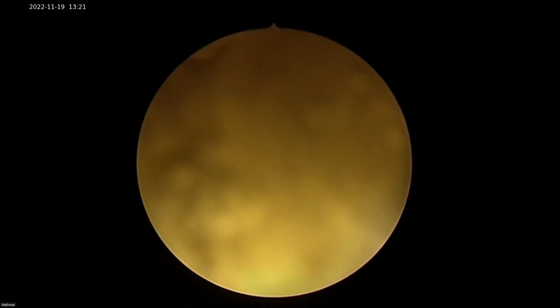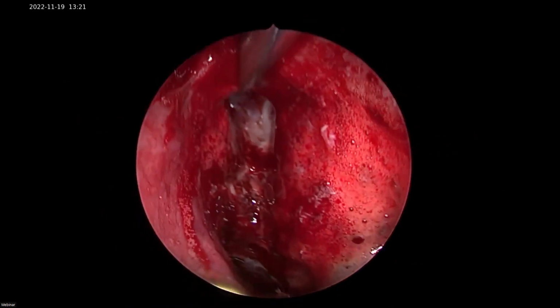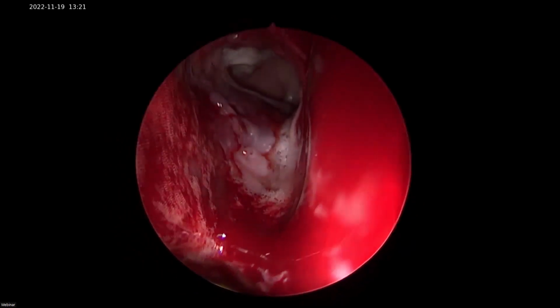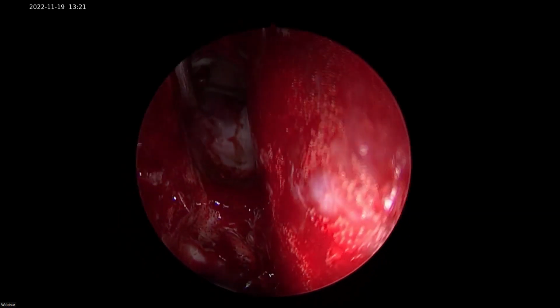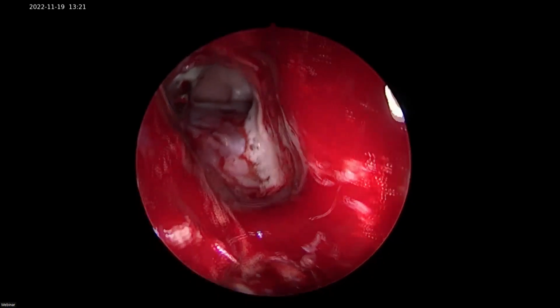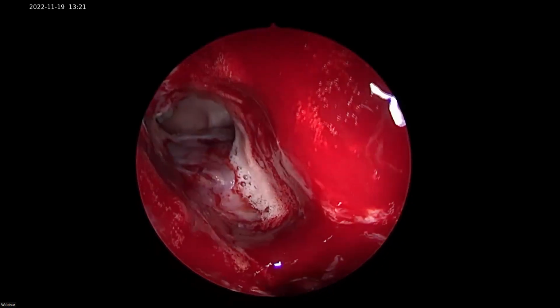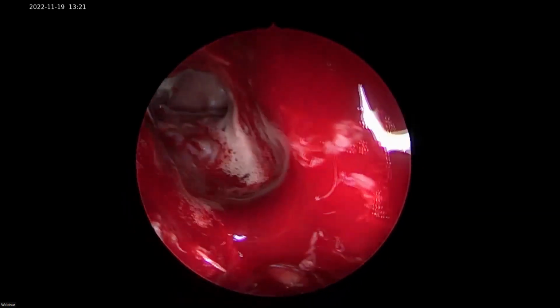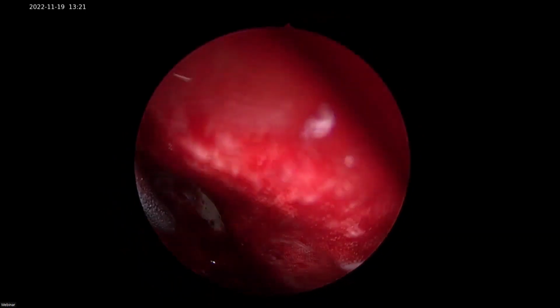Suction, curette, the 90 degree. Try lifting it near the base on one side. Madam, I can't. I have tried every instrument in the OT to reach there. See, it's reaching only till then, just falling short of a millimeter. Right, I can see that. And I don't have the suction in this direction. What about the upward Henkels?